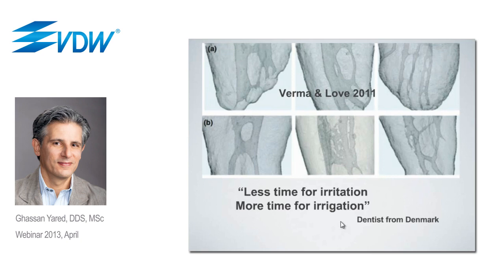We know from the literature, from Dr. Versiani's papers, that almost any tooth has a complex root canal system. And when you see root canal systems like this one, you understand that these are not systems that can be cleaned with an instrument. These cannot be cleaned with a Reciproc instrument, and they cannot be cleaned with a rotary instrument, no matter what type of rotary you're using.